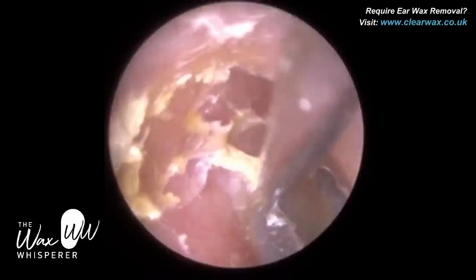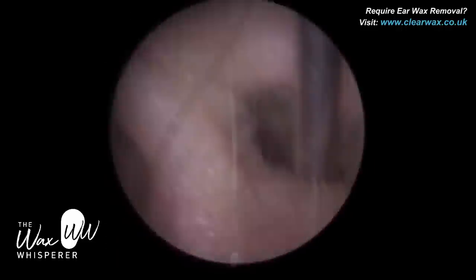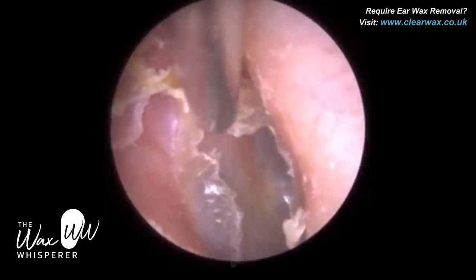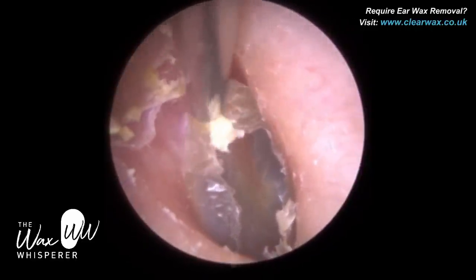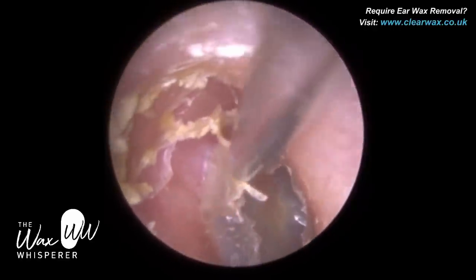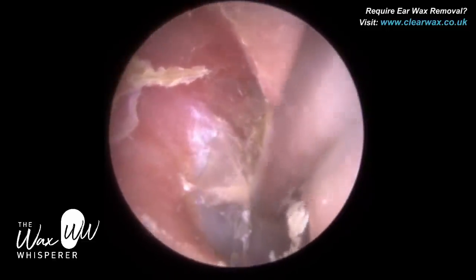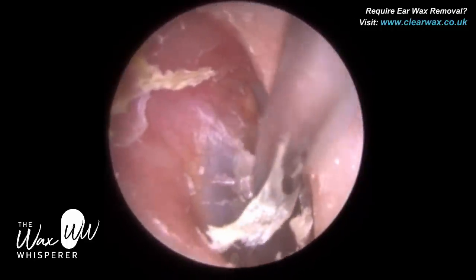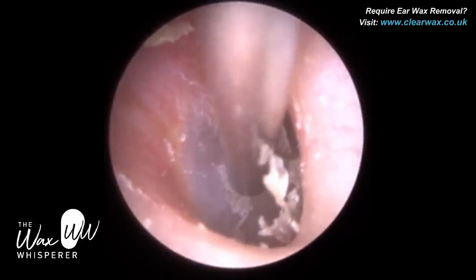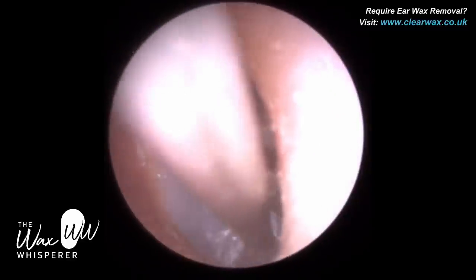In the past I would ask the patient to soften this dead skin using sodium bicarbonate drops, but the patient finds that using the drops sometimes causes a bit of irritation in the ears. So we decided to perform a completely dry procedure. It's a bit more tricky because it takes more work peeling this off the eardrum without the help of any sodium bicarbonate drops. But we're managing, using a fine end tip attached to the standard Zonas suction probe, which I use for very delicate procedures near the eardrum.